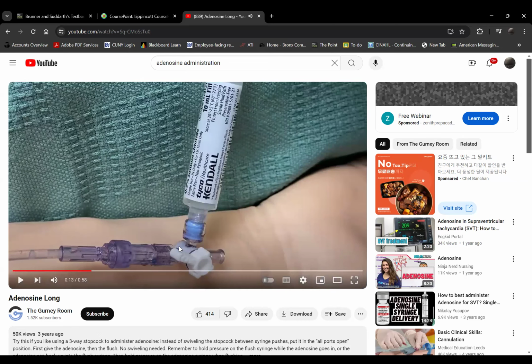This is a three-way stopcock. It's just an attachment. I'll show you, we have one in the lab. That way you can close all 3 or open all 3. This one, the dial is switched to all open. Here's your flush, and adenosine will be attached here. This is your valve to the patient's IV. Because do you have 10 seconds? Imagine if you have to attach the syringe with adenosine, push it, detach it, attach a flush, and then flush again with another one.